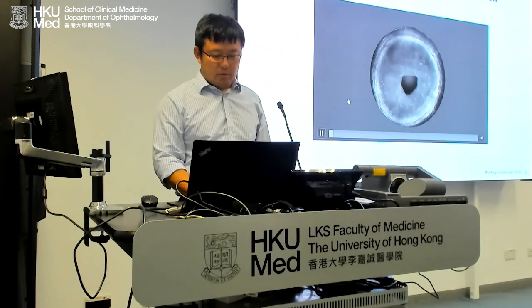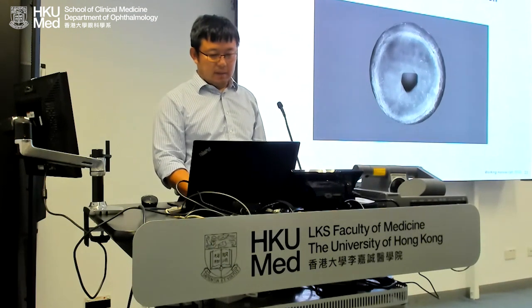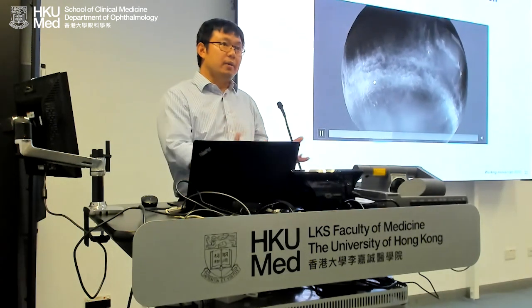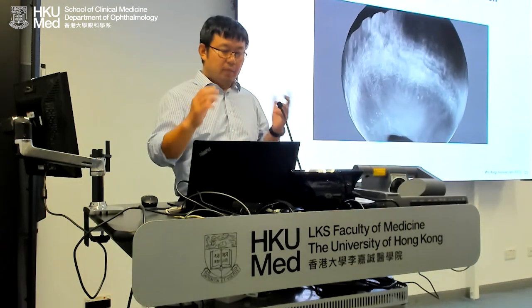This is another video to show the overall visualization of the whole eyeball. And this is OCT of the limbovascular area. And why do we even bother to do all of this?